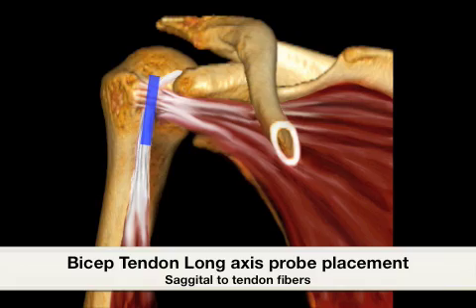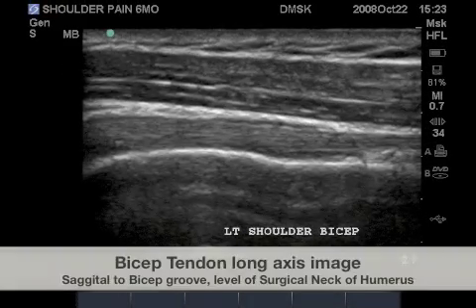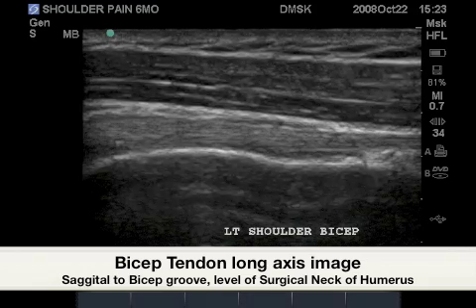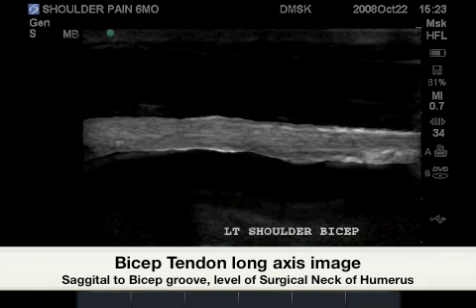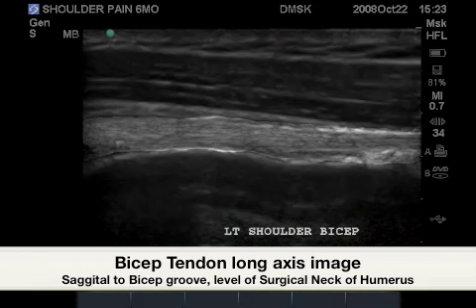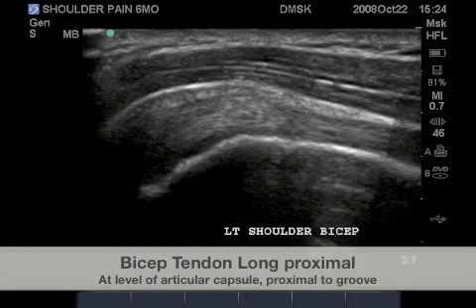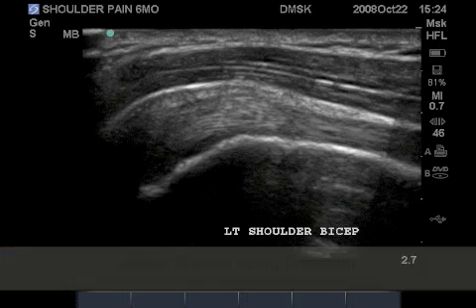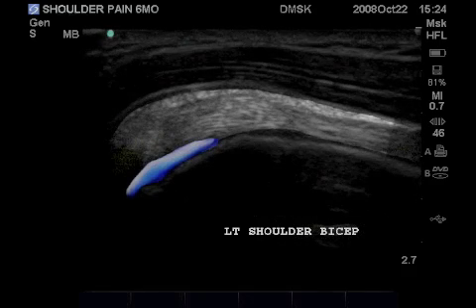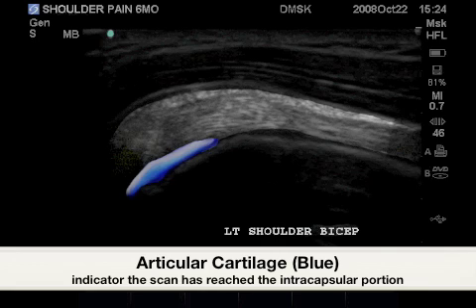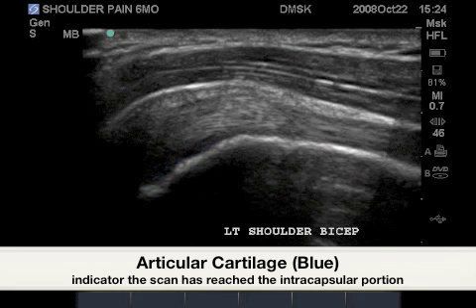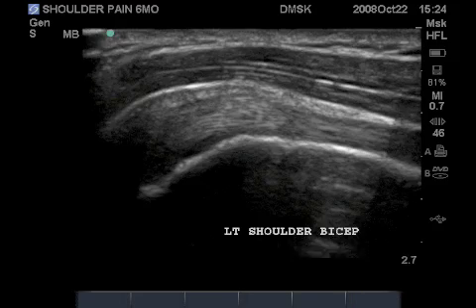We now turn to the long axis of the bicep tendon, shown here at the level of the surgical neck of the humerus. Highlighted is the bicep tendon fibrillar pattern. When the probe is placed higher than the surgical neck, we approach the bicep groove, and proximal to the biceps groove, the articular hyaline cartilage, and the very proximal insertion to the superior labrum will not be seen due to its relationship beneath the acromion process.